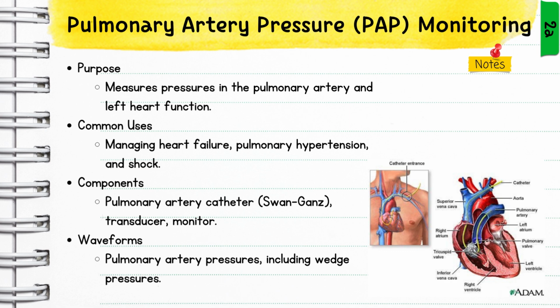I'm going to be honest with you. ER nurses and Swan-Ganz, huh? This is not something that an ER nurse typically does. So I will tell you that I am weak in this area when it comes to interpreting results, because like I said, this is more of somebody undergoing some massive 16-hour cardiothoracic surgery, or they're in the ICU, intubated, a super sick kind of situation. Very rarely. In fact, I have never seen this monitoring in the ER.